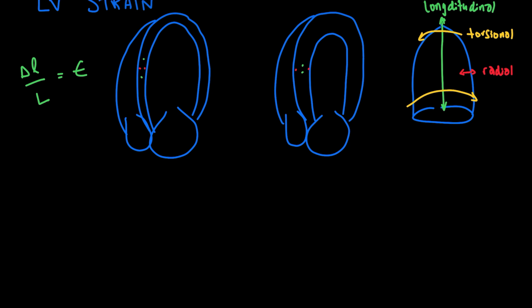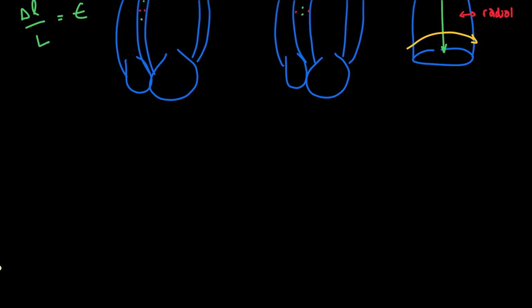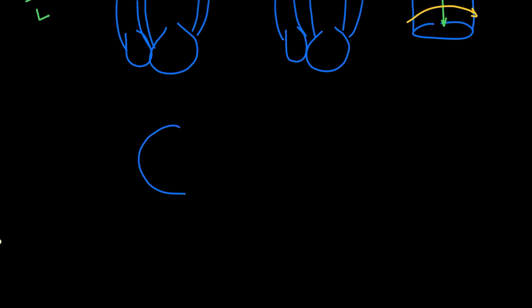And why would we do this? Well, strain can actually be quite useful. It can be an early warning for many conditions before the ejection fraction drops. We'll list those out in a second. I want to make one other point first, which is you may remember how we can segment the heart into various segments.